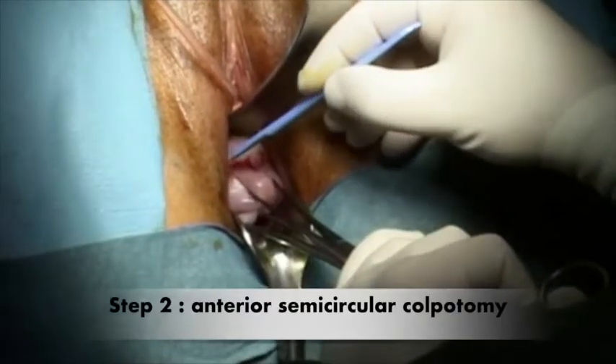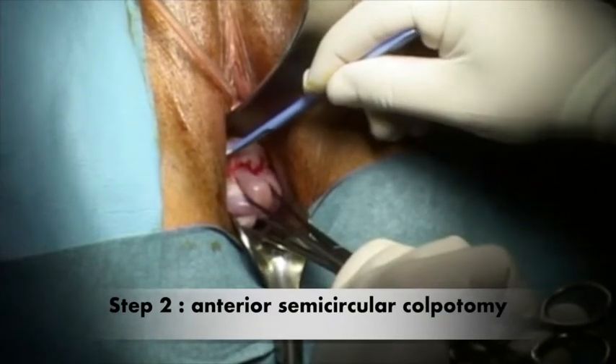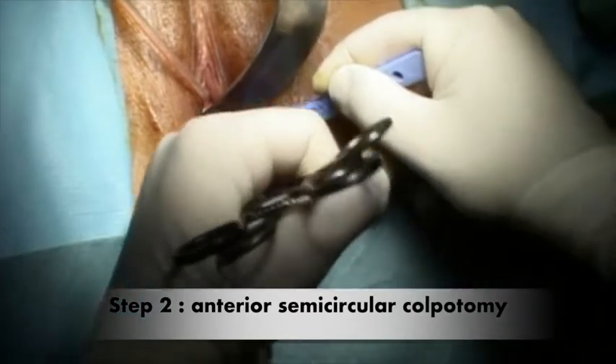The second step consists in performing with a scalpel an anterior semicircular colpotomy on the cervico-vaginal junction.